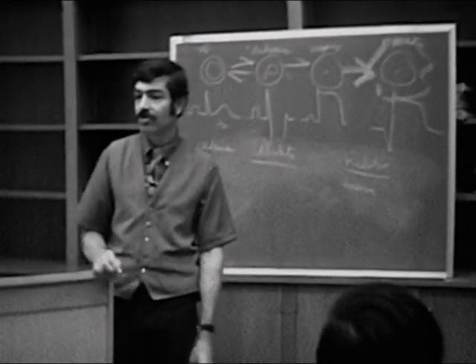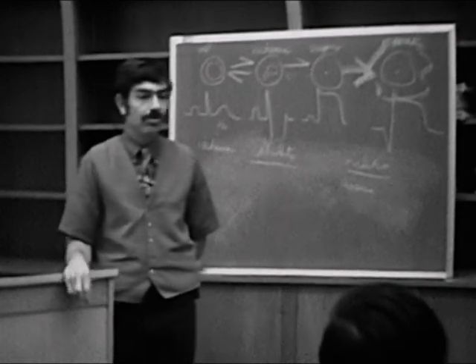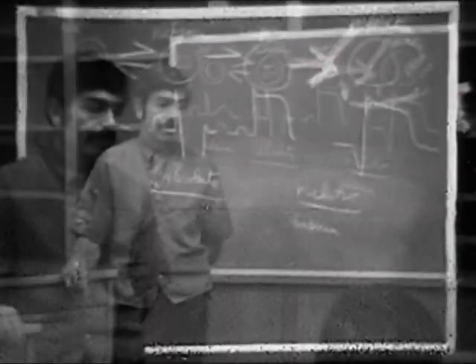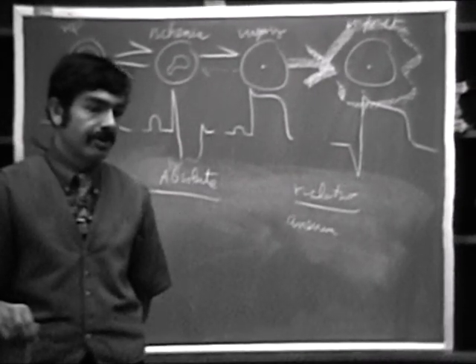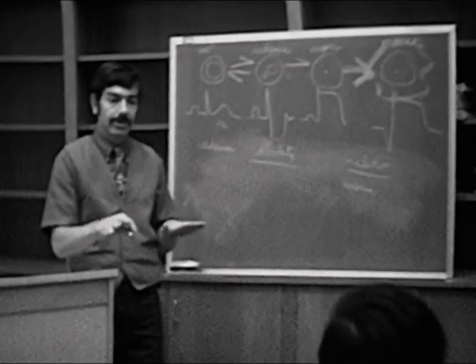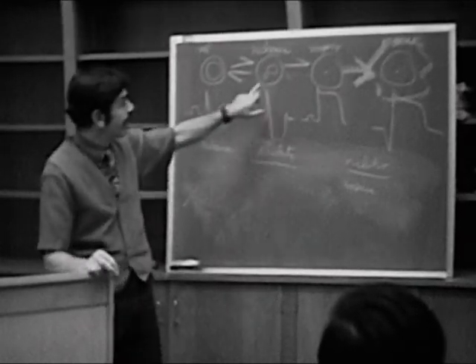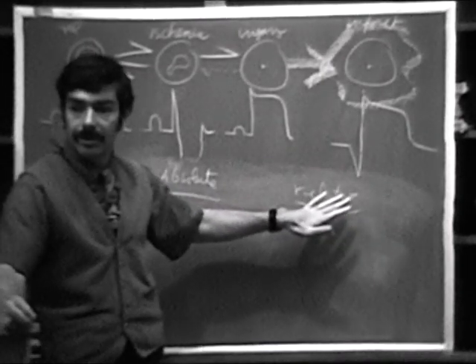There does not necessarily have to be coronary disease. That's the point that I'm trying to make. Just because you see ischemia on the electrocardiogram does not necessarily mean that patient has coronary disease. You just have an excessive workload. Or if you really are looking at gradations, you can have a very small amount of ischemia plus a large load on the heart.